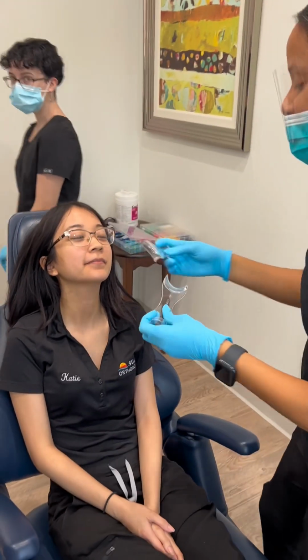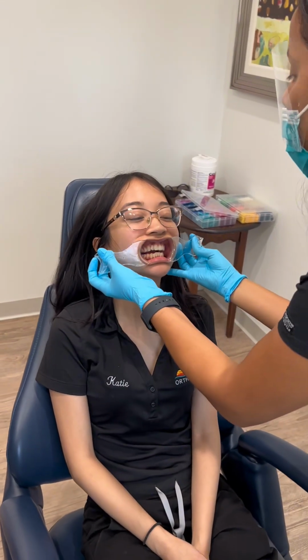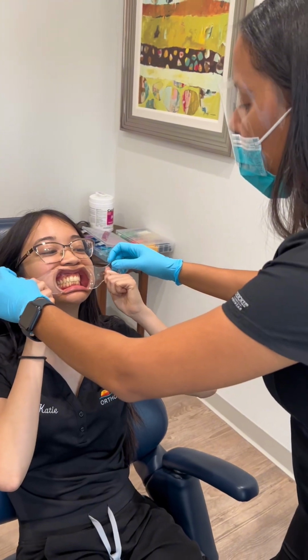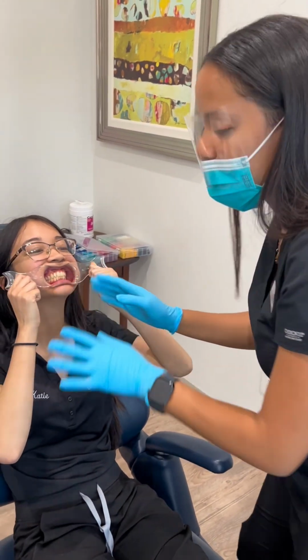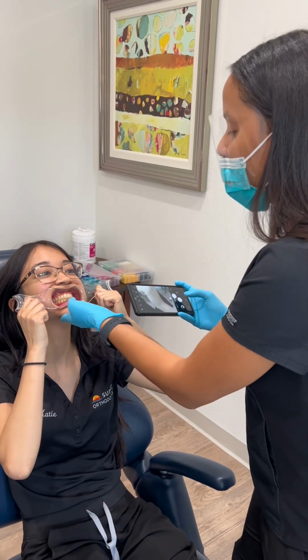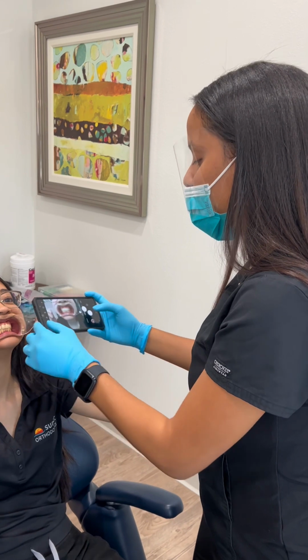All right. So then we're going to do the intraoral pictures. So go ahead, Emily, and hold these right here, and keep that bite there. Awesome. The first one is going to be with the bite. You're going to take a picture just like that.